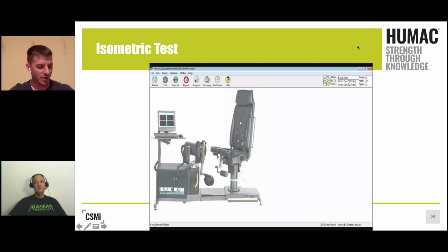Another one I already covered is when you're testing the total knee or other surgical or non-surgical patients, what are you using as your baseline? Here I was telling all about how the LSI was a bad measurement and you had to go by body weight or power. What do you look for? So if we're really talking about, and again, the great part about these questions is they weren't asked ahead of time. You're presenting it to me right now. So it depends on the patient. So we're going to look at that patient's overall function, their height, their weight, their ability to perform.